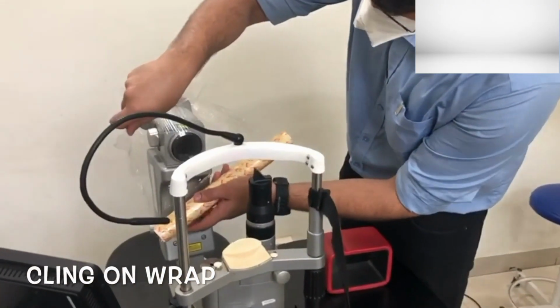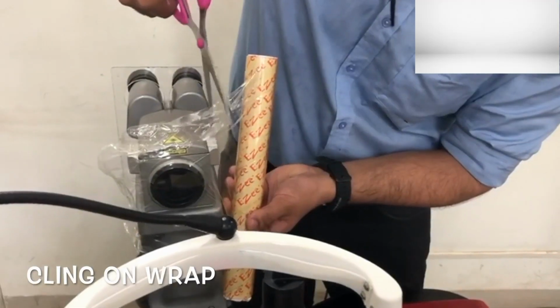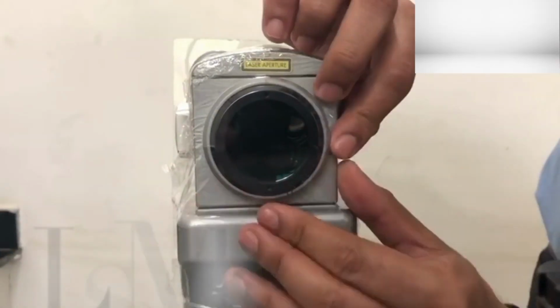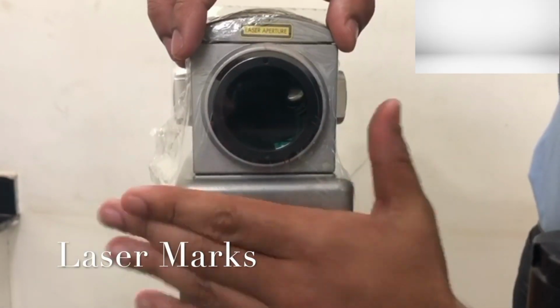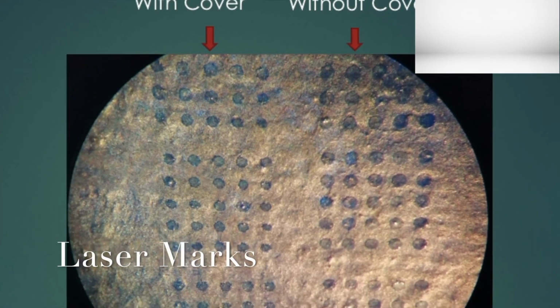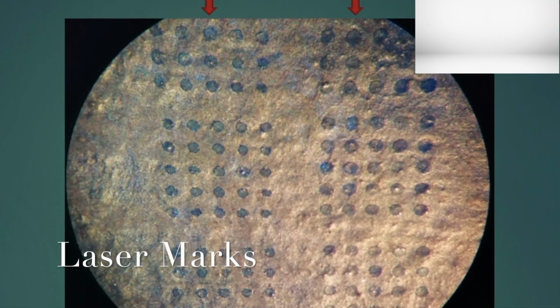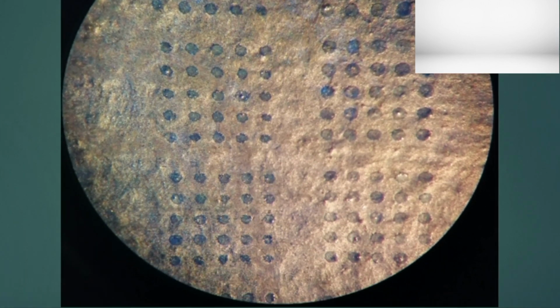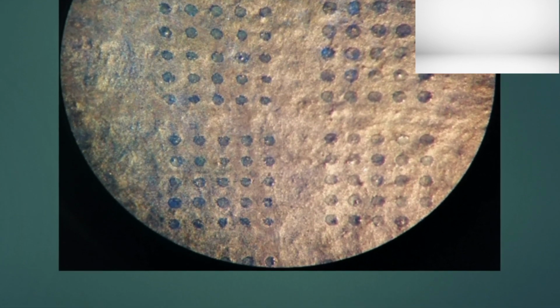In a similar way, you can use the cling wrap to cover your Pascal laser delivery systems. Just make sure there are no bubbles or folds in the front surface. On comparing the laser marks with and without the cling wrap, we found that the ones obtained after putting the cling wrap were slightly smaller in size, but we did not find any significant difference in the clinical scenario.